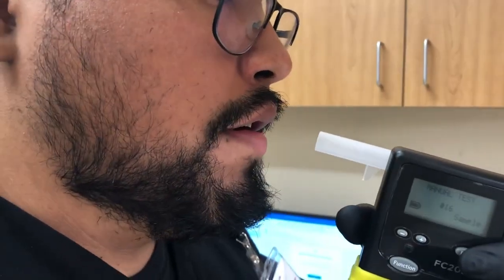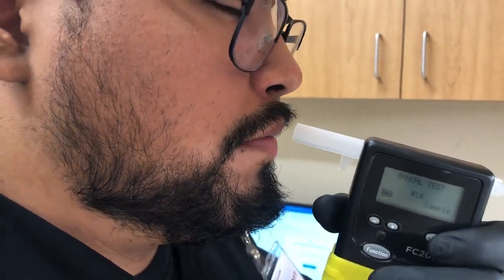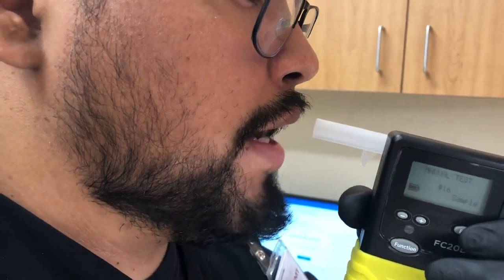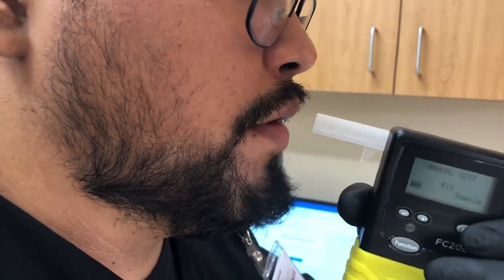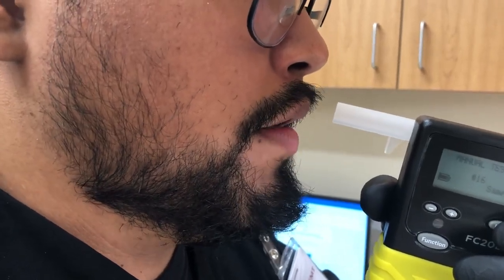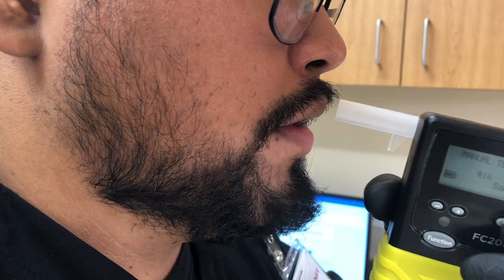So say I'm the patient, and I don't want to give you a full breath or a long enough breath. We'll just hit it pretty short, near the end of their breath. So you're going to have to watch them. Not be quick, but you're going to have to observe everything, so you hit it at the right time.